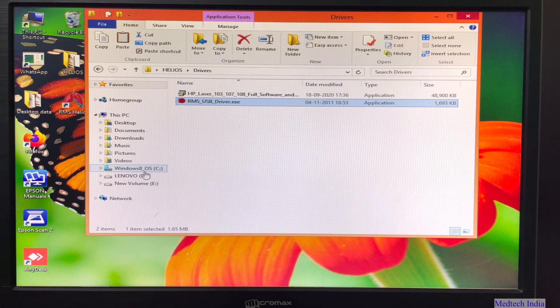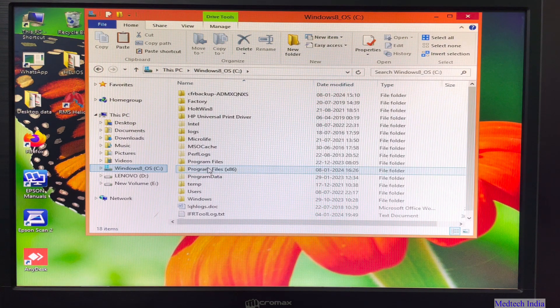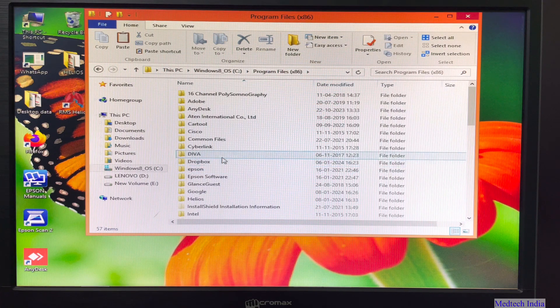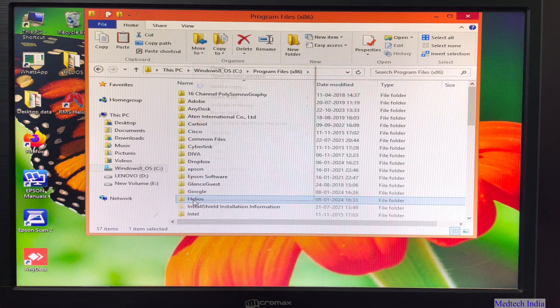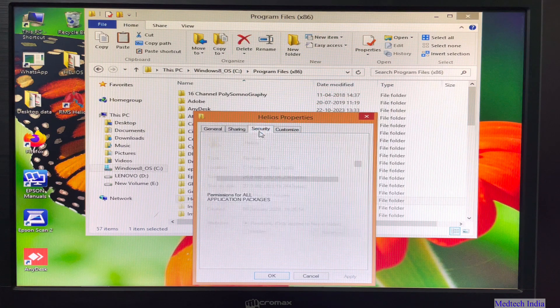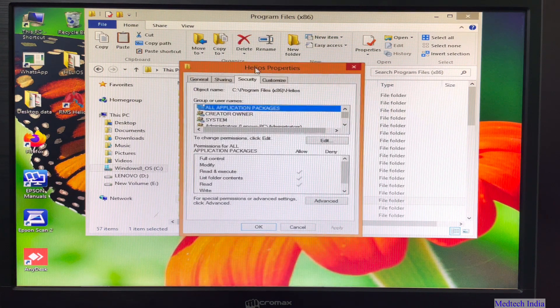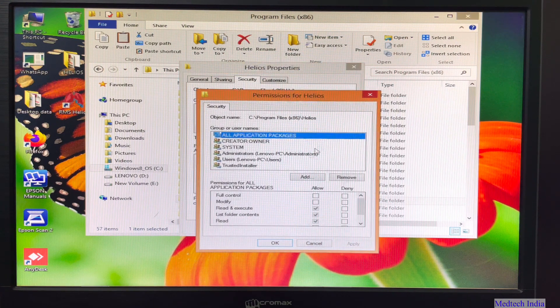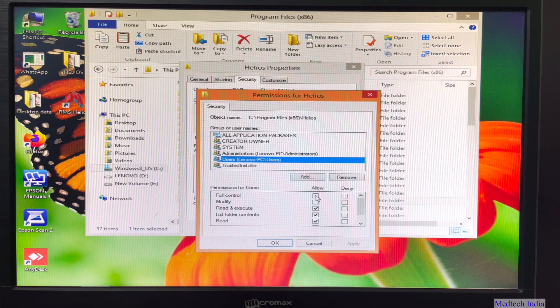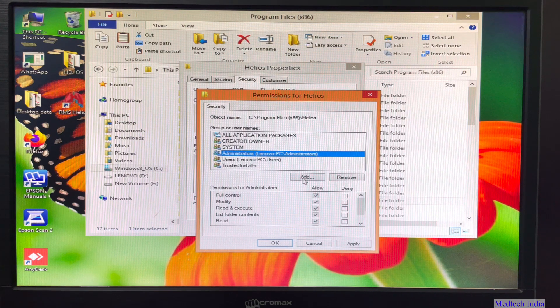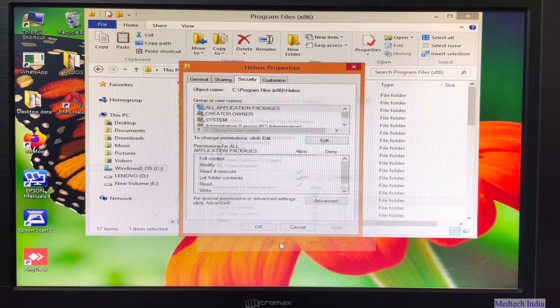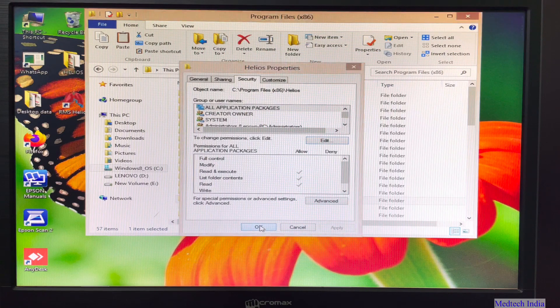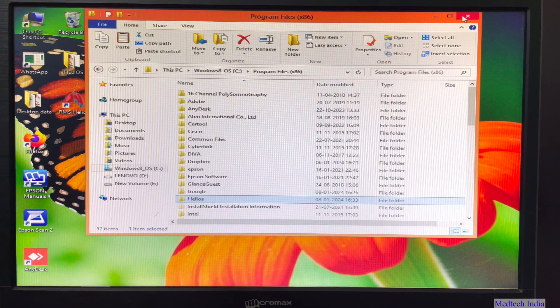Now our next step is to click on C drive. So here we will get program files 86. So double click on that. Here we will get Helios folder. So right click on that folder. Just go to properties. Then click on security. So now we will click on edit. Then just go to users. Then we need to tick on full control and modify both for users and administrators. Then apply and OK. OK. So after that close this window.